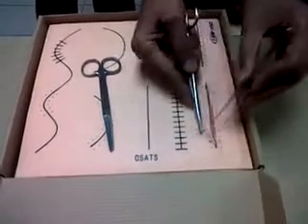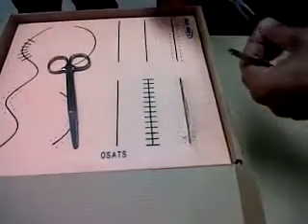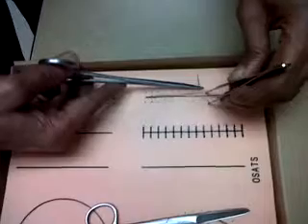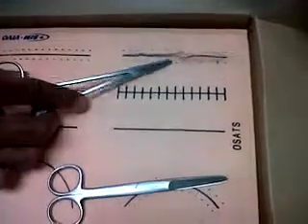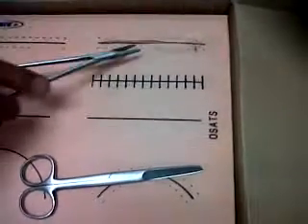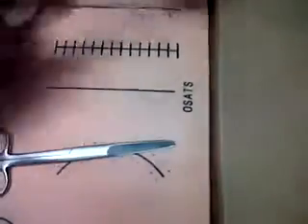The first step is pretty much the same — take a full thickness bite, go to the other end and take a full thickness bite. Push and take it out. Keep one end short as usual. Now take it again the reverse way and go a little far away, go in the opposite direction. When we tighten this, it may not be cosmetically as beautiful, but what we have achieved is that in one knot we have covered a big area and stopped the bleeding in that place. Tighten and put as many throws as required — six throws for nylon, at least six throws for nylon. So this is horizontal mattress.